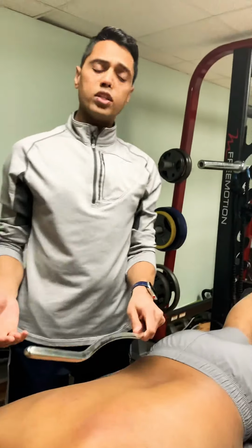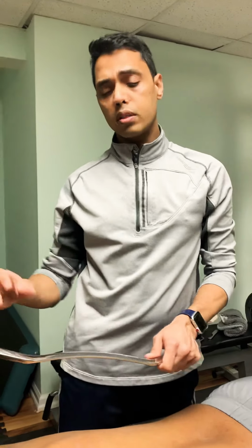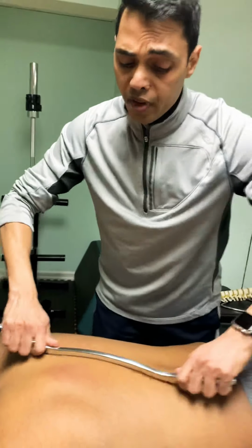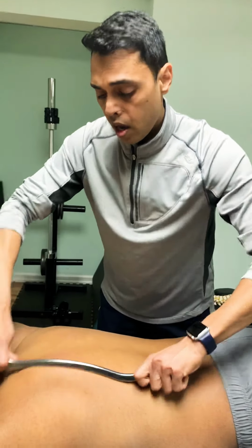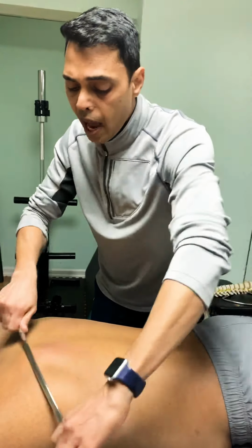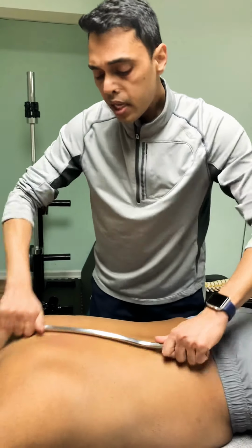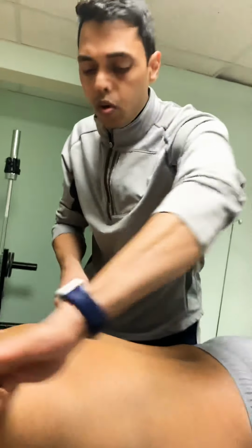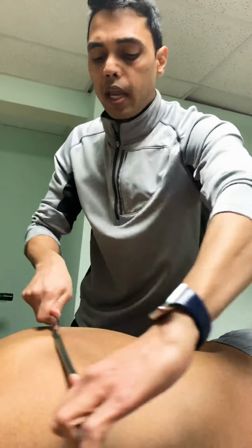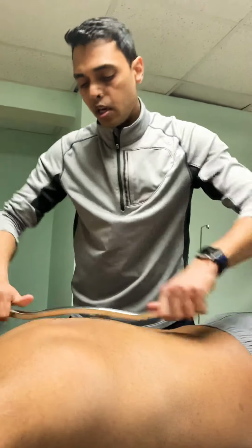And there's a progression to do this, which you'll also learn in subsequent courses you take or more videos if you want to see. I'll tell you why, what direction, what pressure. But for now, I want you to see it's a lot easier for me to move with my tool and it's comfortable for the patient for mobility.